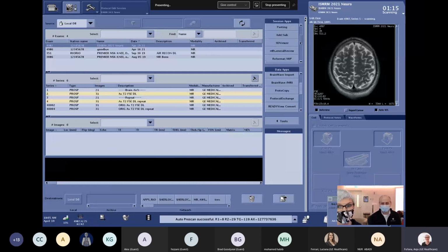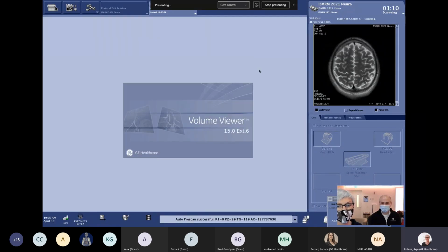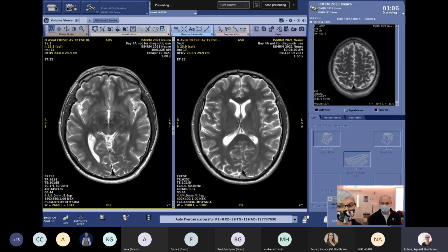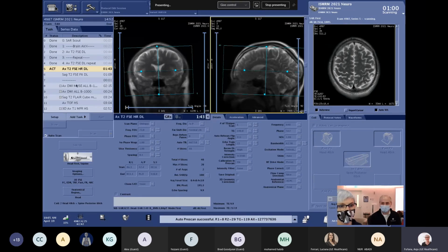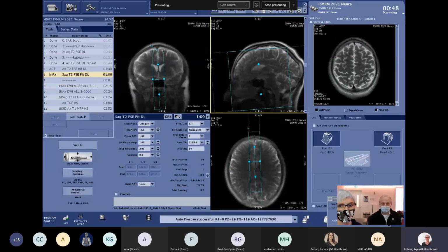And as you mentioned, it helps you to go faster with higher resolution. But you can do some really interesting things with your protocols. As bandwidth increases, you would typically lose signal. But with those particular protocols, you're going to get sharper images, because of the blurring that could happen when using a smaller bandwidth.